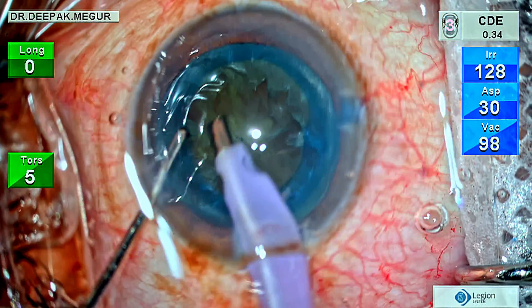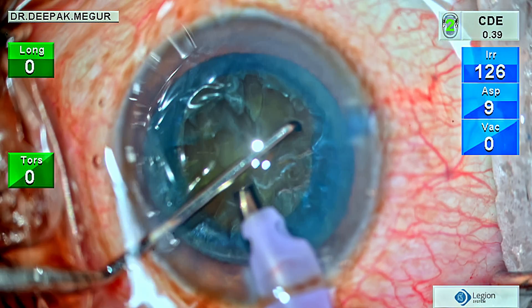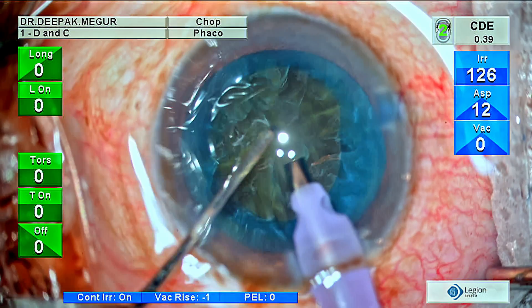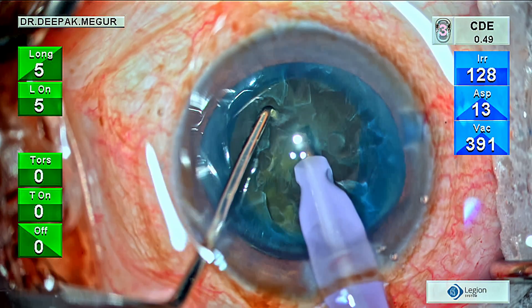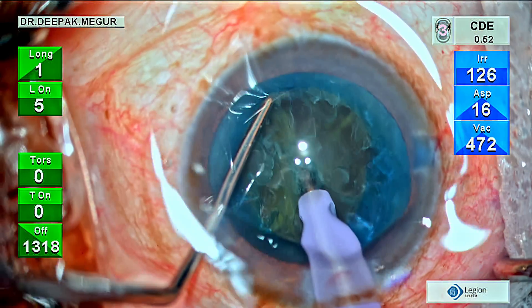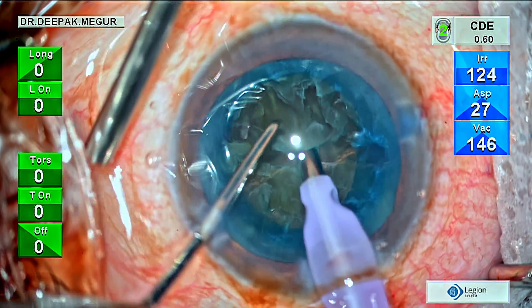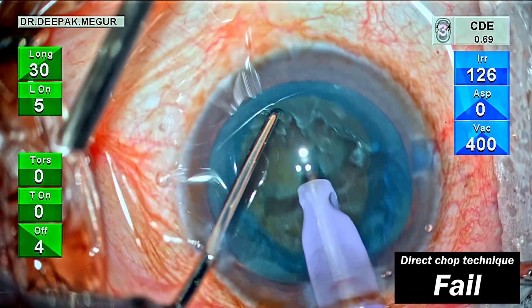As is customary, the superficial epinucleus is removed. Now is the time to go ahead and do the direct vertical chop. I've used very low power so that I can get some hold, using very little amount of power to bury. As soon as my chopper attempts the chop, the grip is lost. I try it at a different place but the result is the same — the nucleus is too soft and squishy and I just don't get a hold.